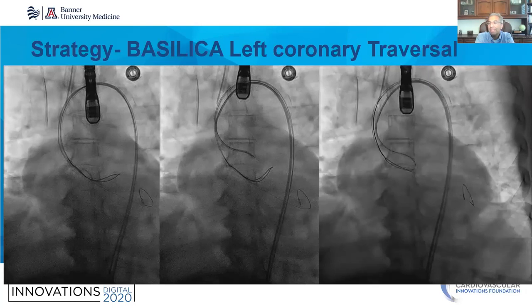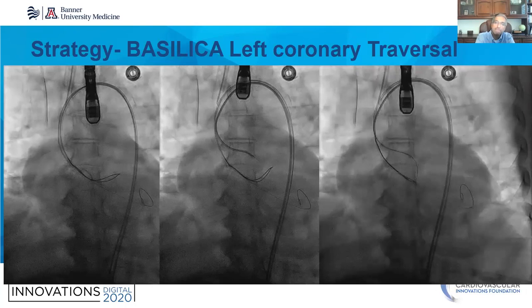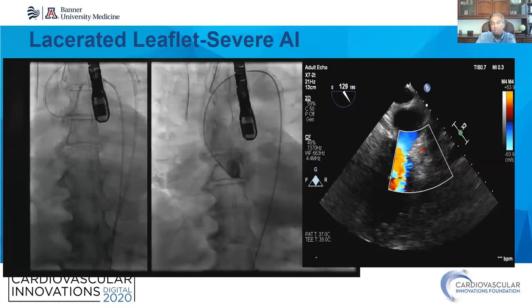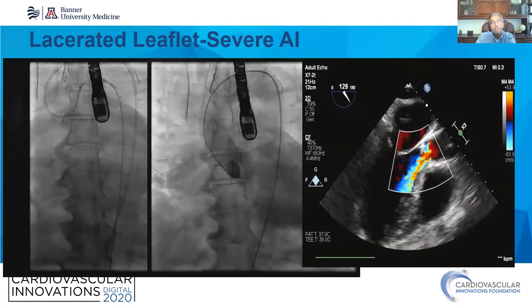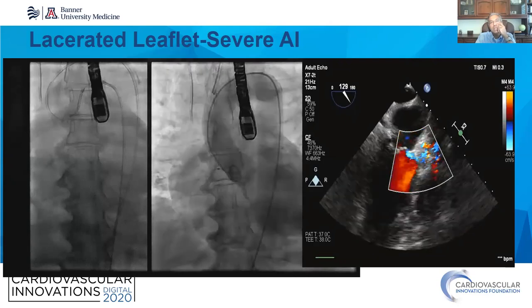We then lock the piggyback and then advance the wire through the tube with the snared wire on the contralateral side, and are able to bring the flying V to the zone of interest, which is under the left coronary cusp. Once we've done that, we perform the laceration itself with the Bovie set at 70 cut without any coagulation.